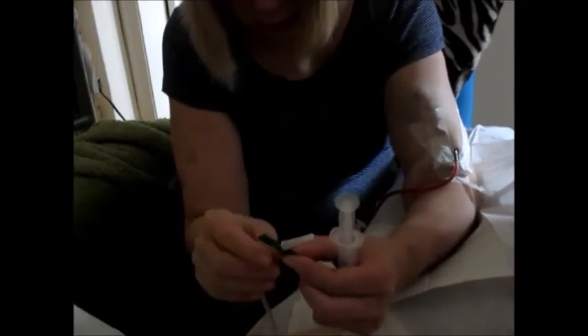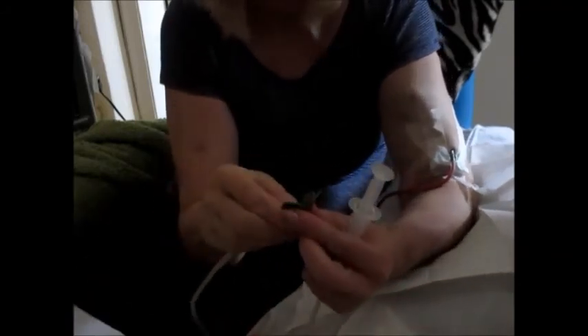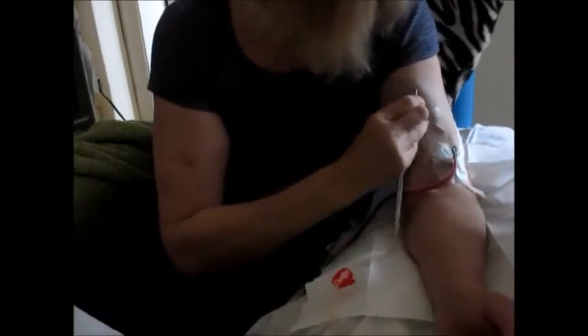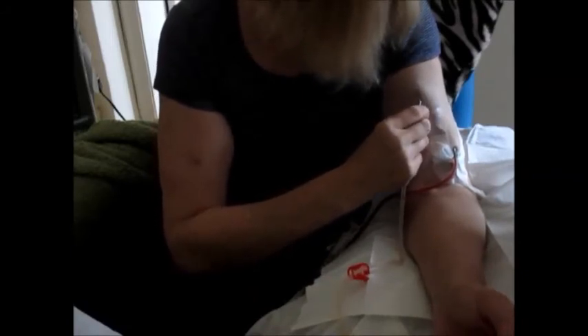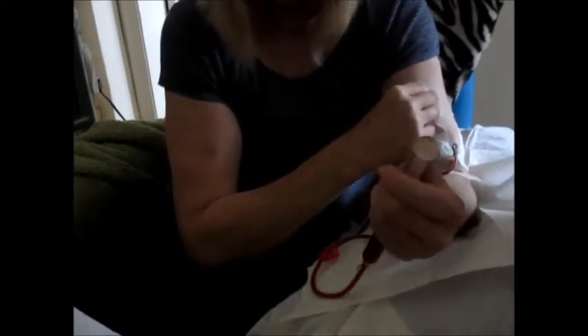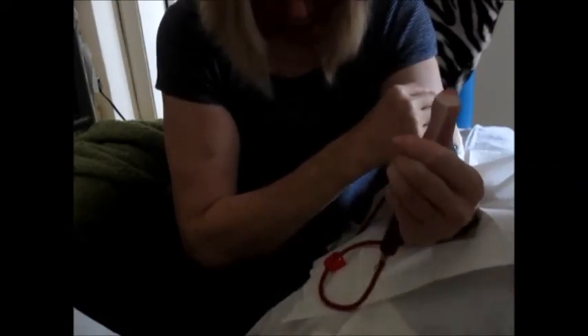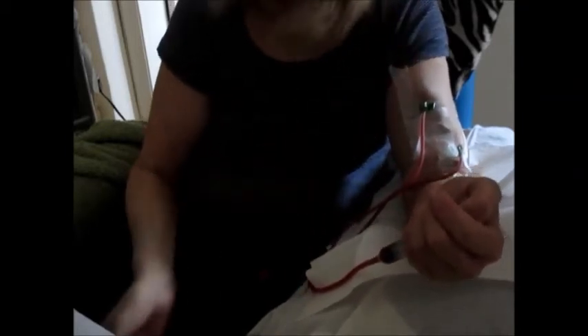Now I'm going to insert the venous needle. I make sure the bevel is facing upwards — facing me. The needle should again be at least three fingers apart from the arterial needle, which helps prevent recirculation of the blood full of toxins back into the blood that's already been cleaned through the dialyser. I'm just taping that down.